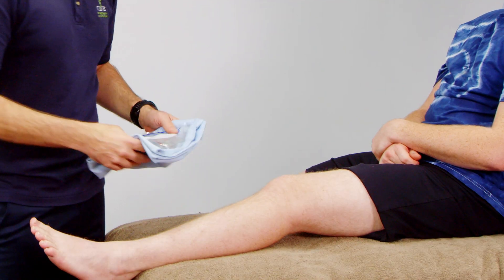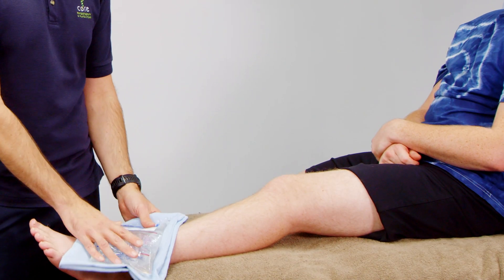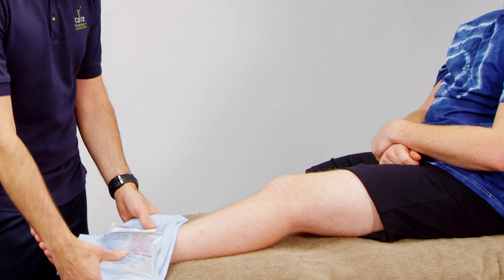When using it as a heat pack, you can heat it straight out of the freezer — just pop it into your microwave and follow the instructions on the pack. Generally it says about a minute, but that can vary from microwave to microwave. We follow the same process of using a pillowcase or tea towel and placing it over the area we're trying to heat.